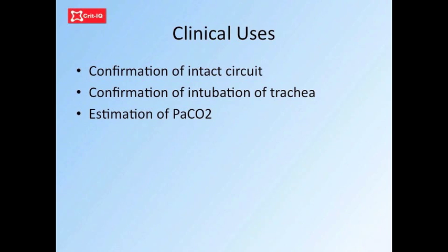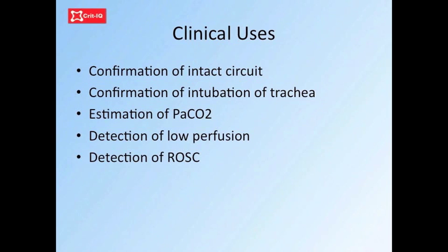The clinical importance of the absolute value of end tidal CO2 is debatable, but a trend or sudden change can be highly significant. Because CO2 excretion from the lungs relies on the pulmonary perfusion, a sudden reduction in end tidal CO2 can indicate a low perfusion state. This can be seen in massive pulmonary embolus or in cardiogenic shock, or may result from an accidental migration of the tube into a bronchus. By extension, CO2 monitoring can also be used to detect return of spontaneous cardiac output or even measure the efficacy of delivered cardiac compressions.